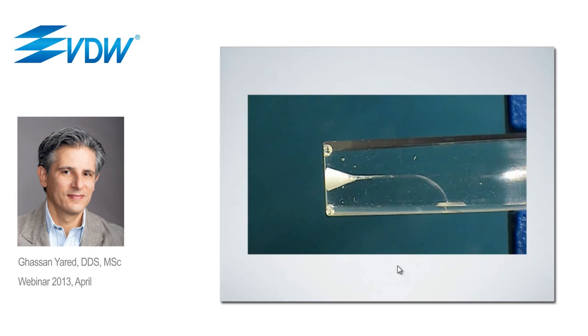I'm going to show you here a video that shows that binding does not happen, and that torsional fatigue is in a way eliminated. You will see here a Reciproc instrument being used in this canal in one shot. So no irrigation, no patency. It will go from the coronal orifice to the apex in one shot. And this explains that binding does not happen and that torsional fatigue resulting from the cutting will not happen, as you will understand.